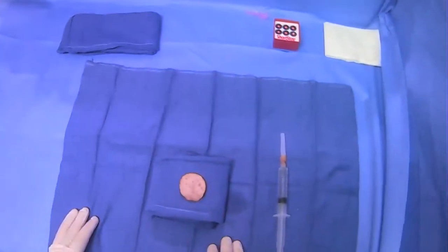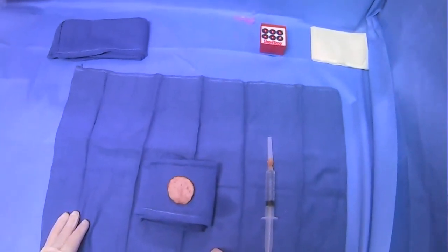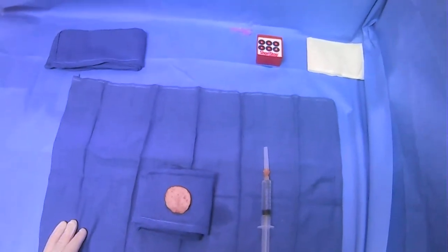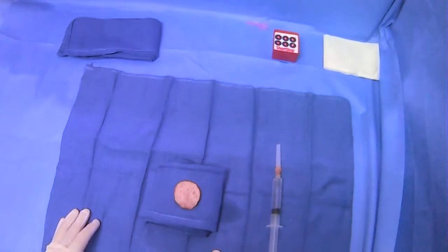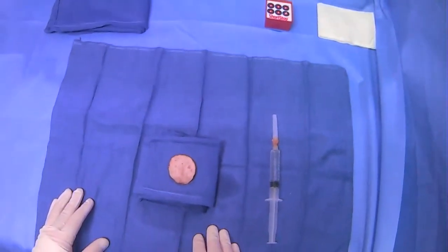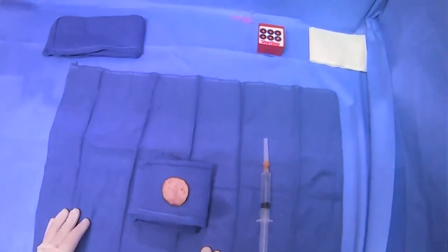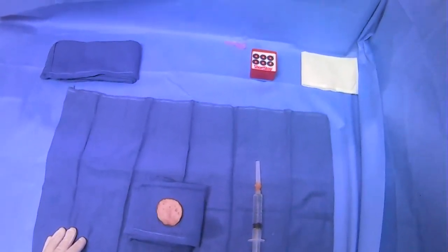You could use something like maybe a piece of chicken that has the skin still attached as well, to practice making your wheals. But we'll give this a shot just because we don't have to worry about refrigeration or meat contamination, and it's still a good medium to practice on.